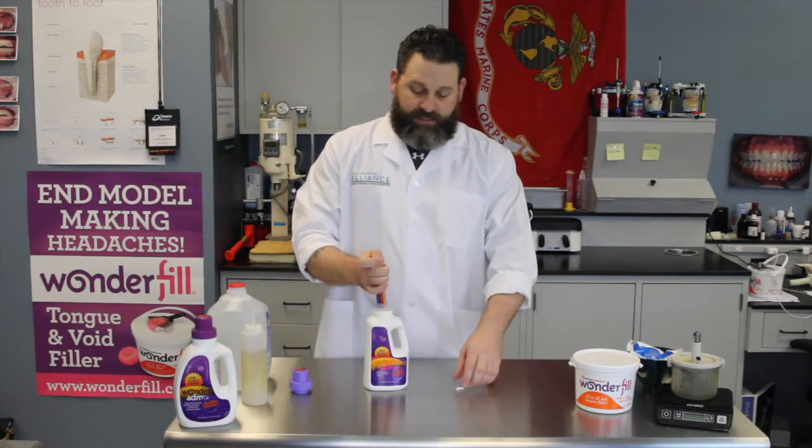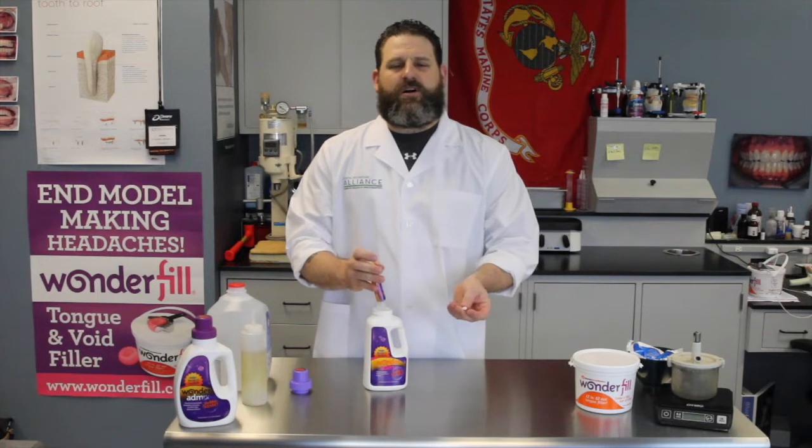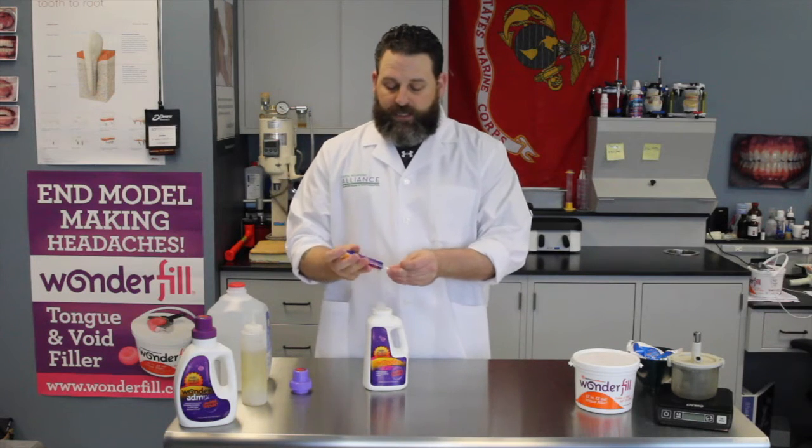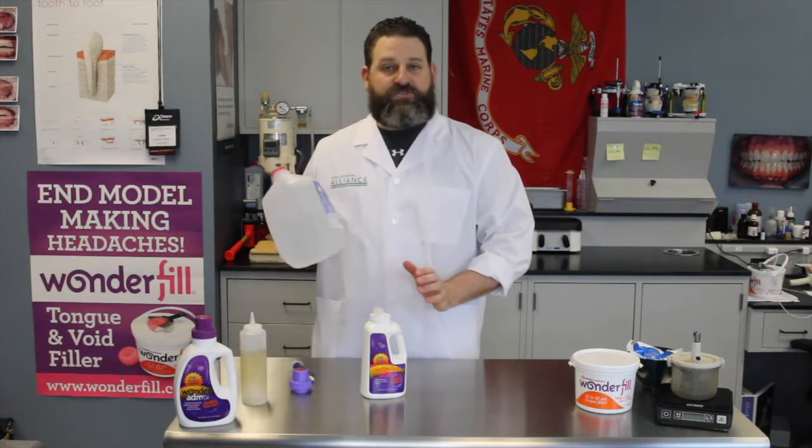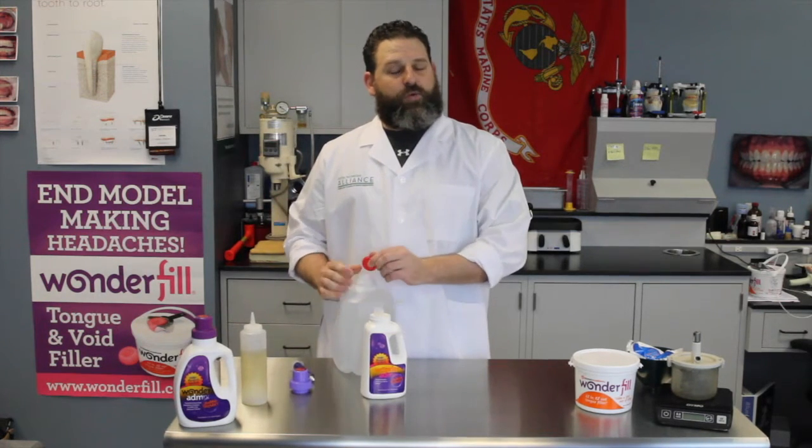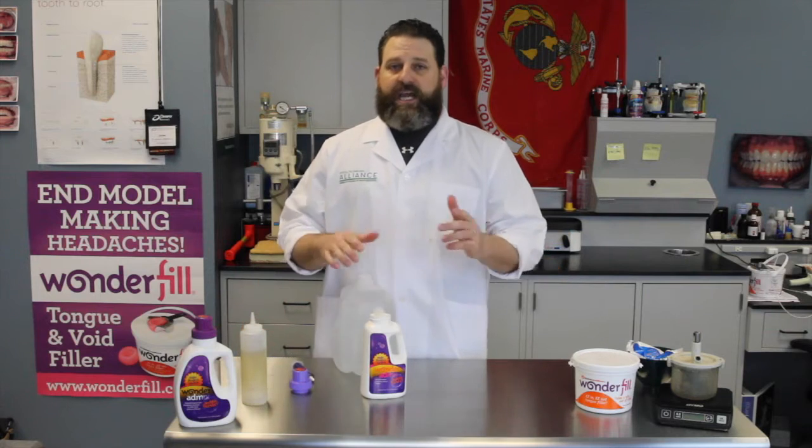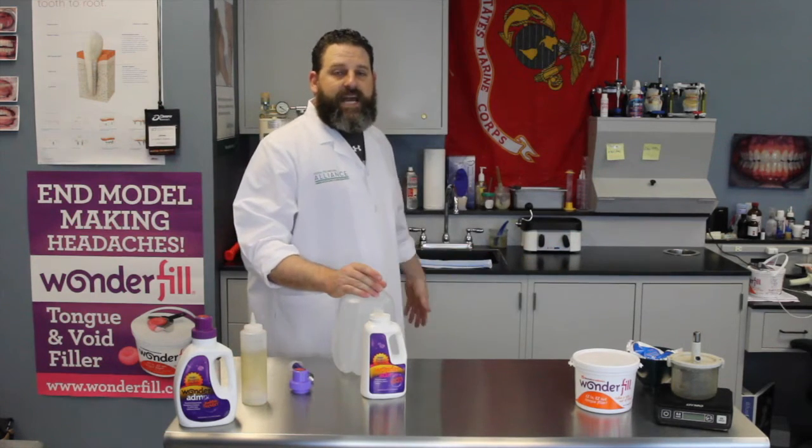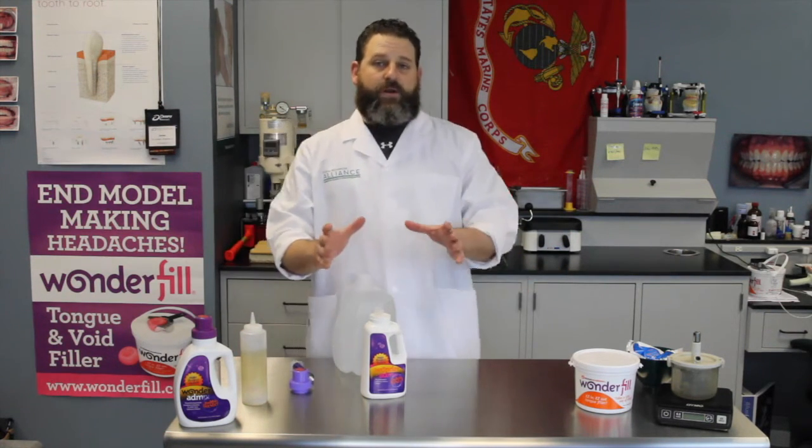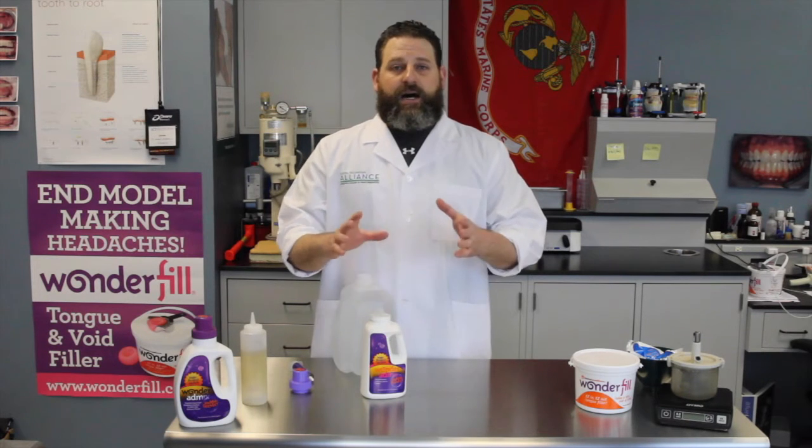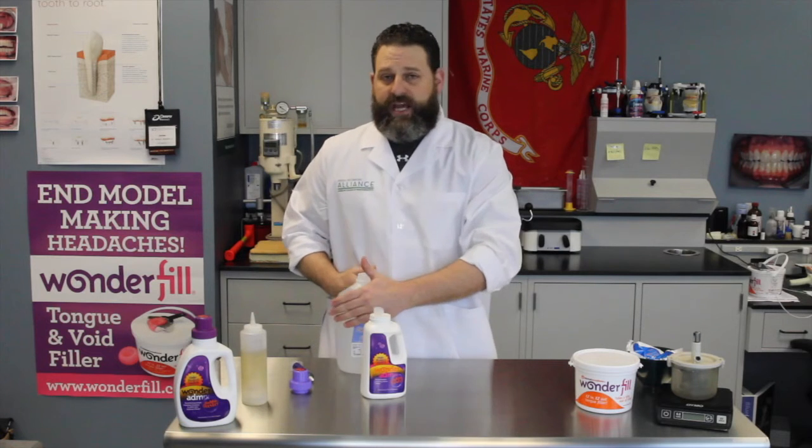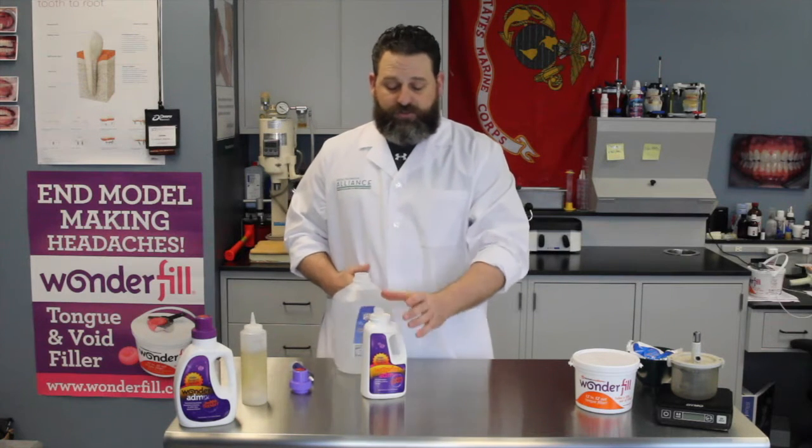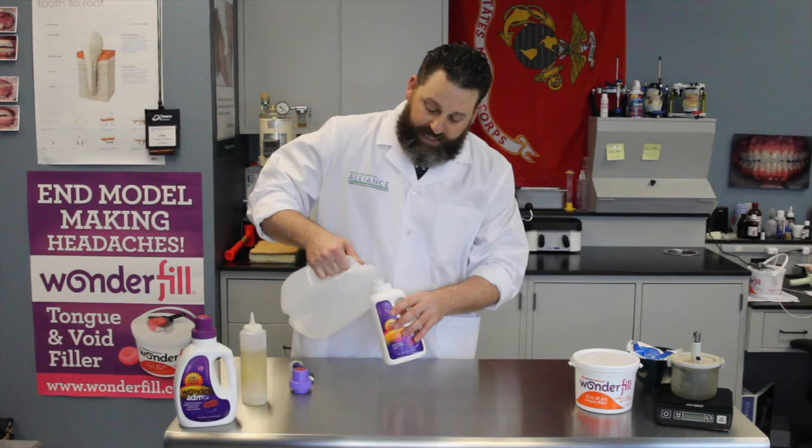The bottles are going to come empty so you can save on shipping costs because all we're going to do is add some water. Once the AdMix is in the jug, we want to use distilled water. We're not going to want to utilize the tap water from the faucet because the tap water is going to have different minerals, different deposits, and it might make our models a little less accurate.